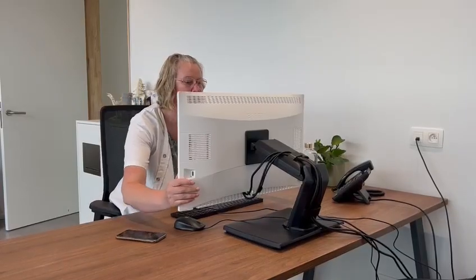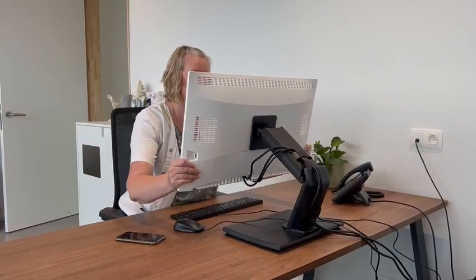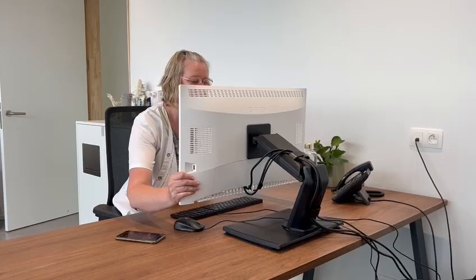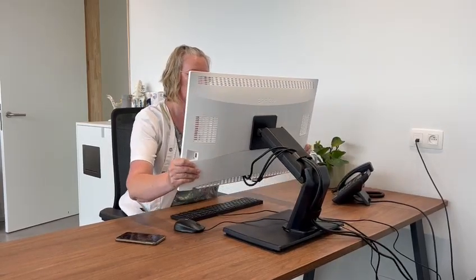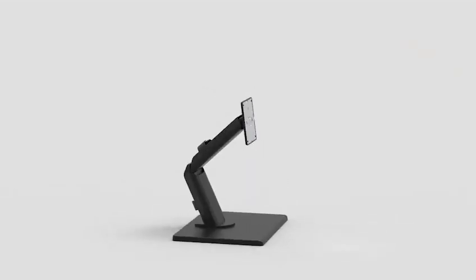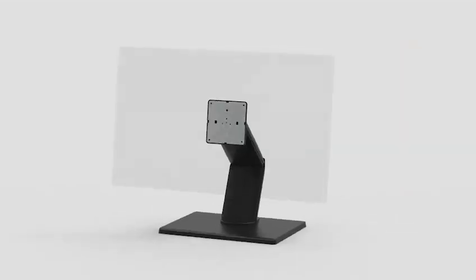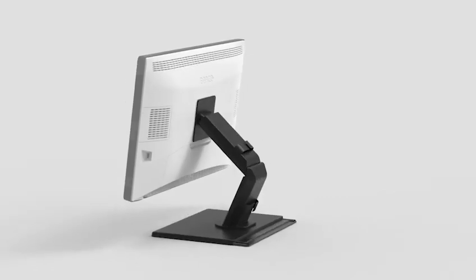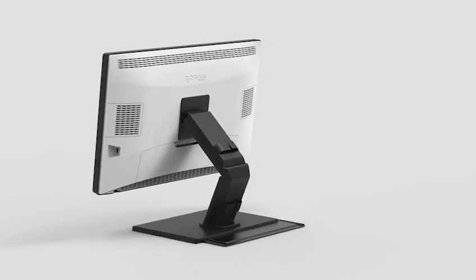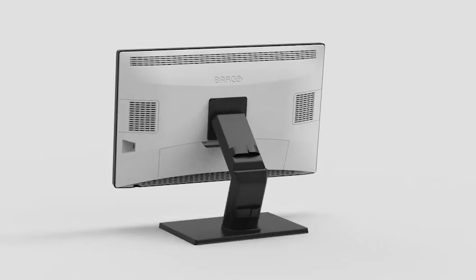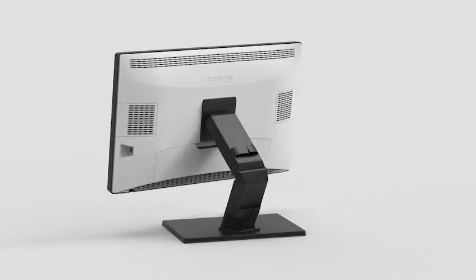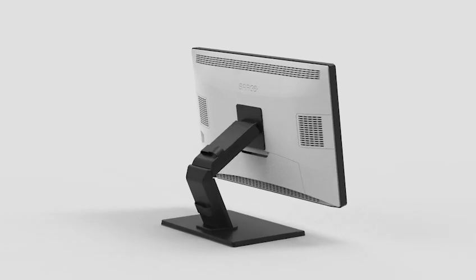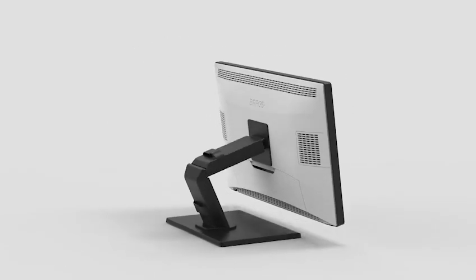With a simple grab-and-pull motion, the screen can be effortlessly positioned to your own standards. The display can be moved back and forth, rotated, tilted, raised or lowered.